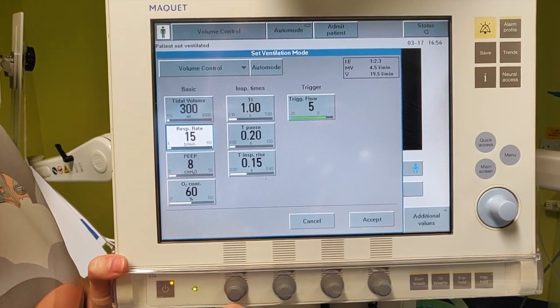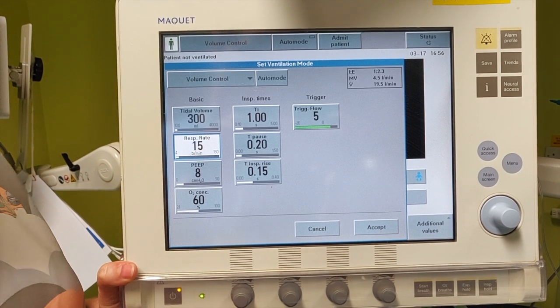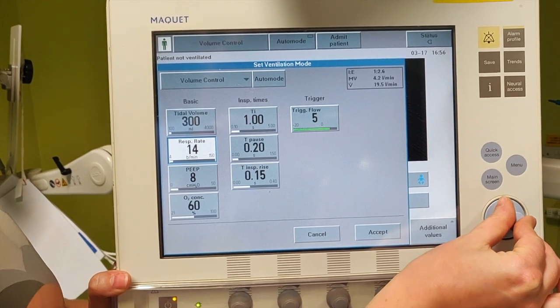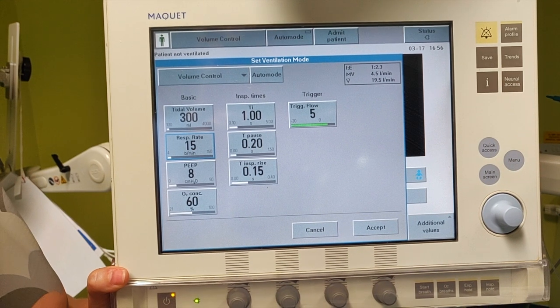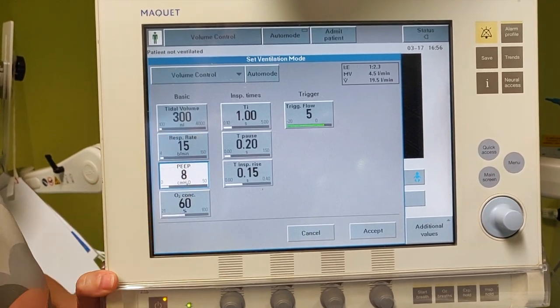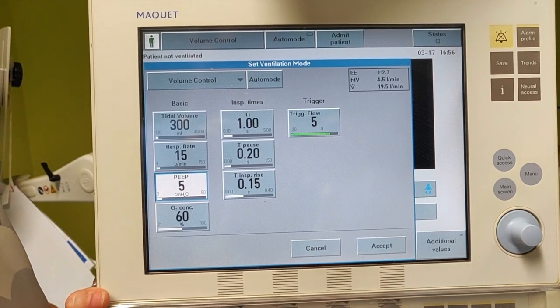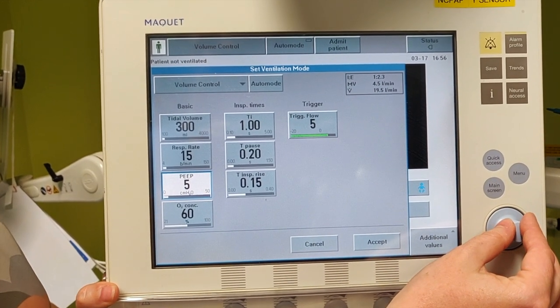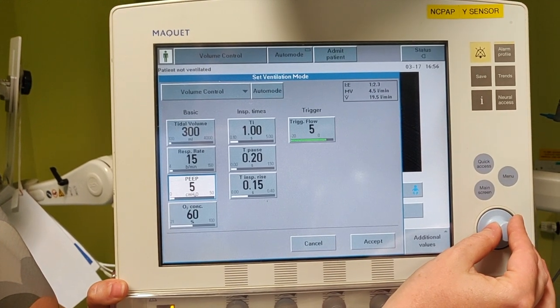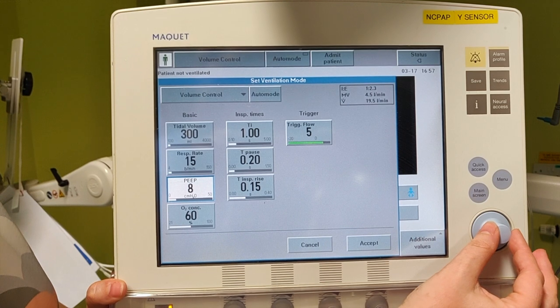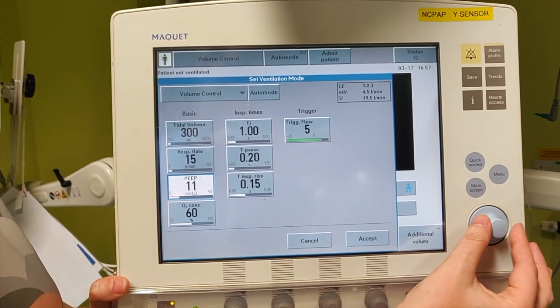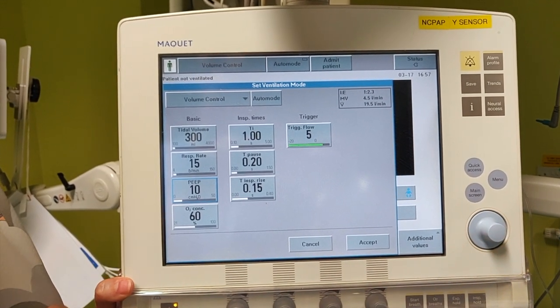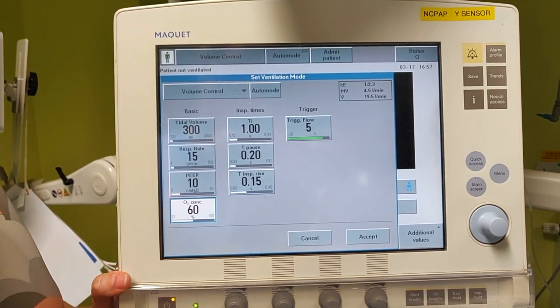For respiratory rate, we're going to set up something sensible for age. We're going to set in between 10 and 15 — I'm going to leave 15, as it's the same one my colleague used in the other video. For the PEEP, the minimum we tend to set up will be five, which keeps the functional residual capacity in line. But because we anticipate you'll use this teaching to ventilate patients in acute respiratory distress syndrome, you'll need to think about whether you need higher PEEP values. You can decide based on the ARDSnet strategy — let's say we're going to need a PEEP of 10 to start. In terms of oxygen, you're going to start high and then drop it as soon as you can.